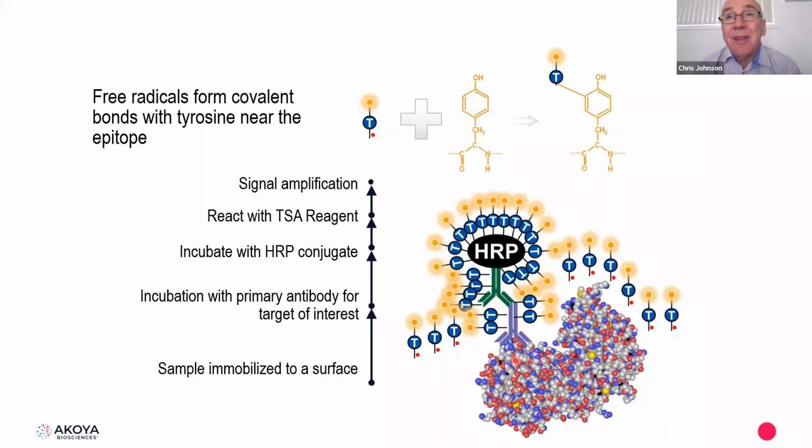Yeah, so that's kind of an empirical decision to some extent. Now there is a list. Akoya has a list of where you should place the antibodies in terms of position, but the rule of thumb is that the dyes that are weaker in emission, like the 690, the more reddish dyes, tend to be in that area.